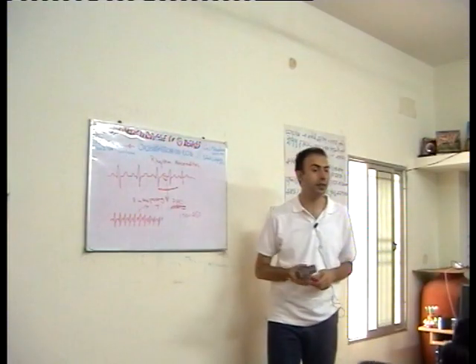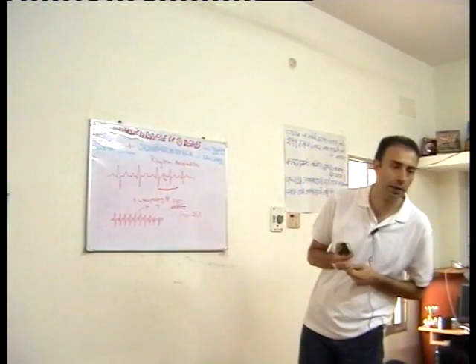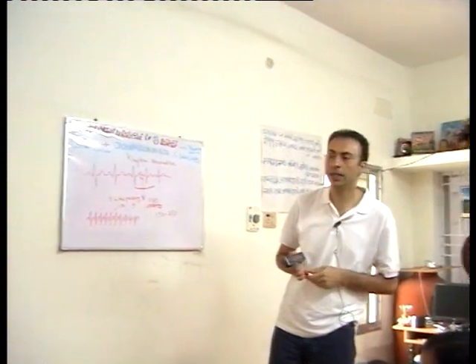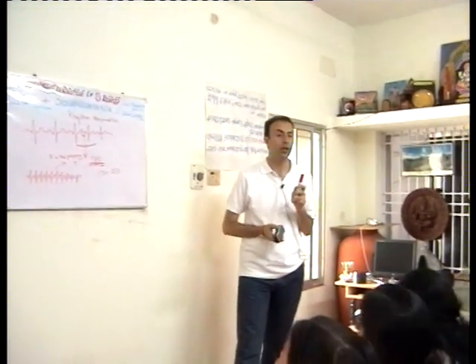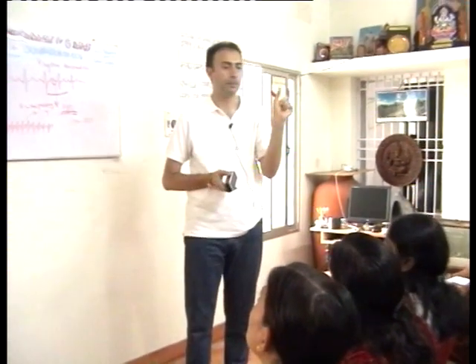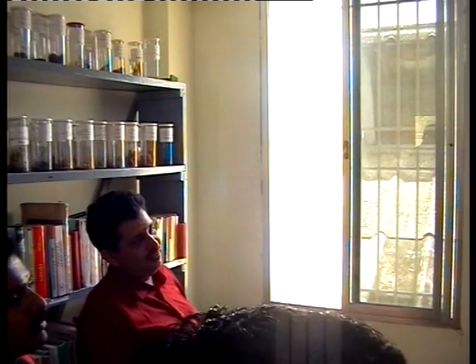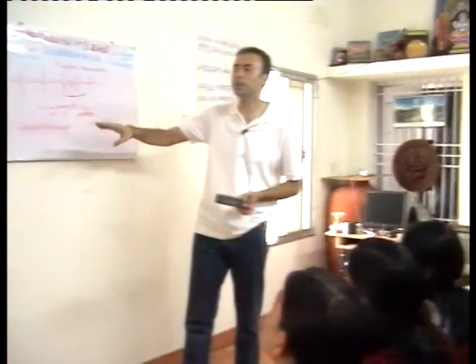You see, the regularity is there, but the speed is very high. So how do we differentiate it from sinus tachycardia? In sinus tachycardia, we have normal P, normal T. You remember, in sinus tachycardia, all the shape is normal. Okay? Only tachycardia is there. Paroxysmal atrial tachycardia and SVT can have the same feature, but it is paroxysmal.